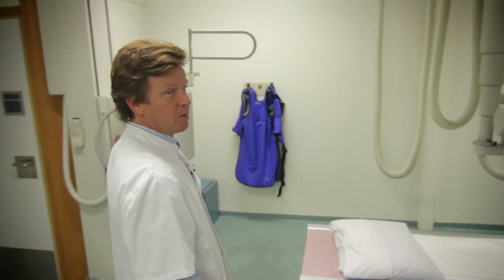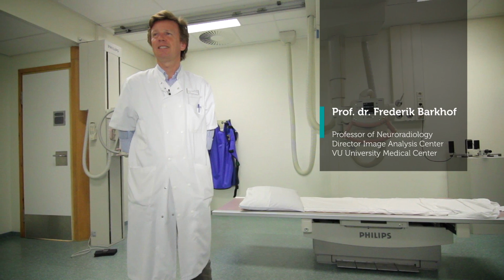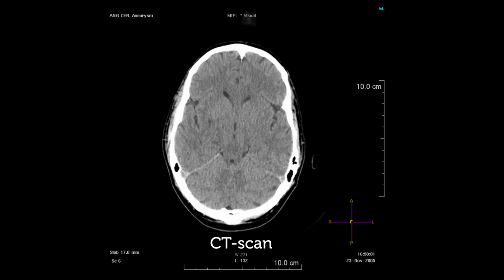So now we just entered one of the radiology rooms where we perform diagnostic X-rays. This is one of the oldest imaging techniques, but it's still used very widely. So you can make simple X-rays. These are two-dimensional pictures, for example, to look at fractures. But in fact, a CT scan is also based on X-rays, but now you're lying in the tube and the X-ray is circling around you and taking many small pictures and then calculates an image, which is then a cross-sectional image. And then you can slice through the whole body. But the fundamental contrast is still X-ray.